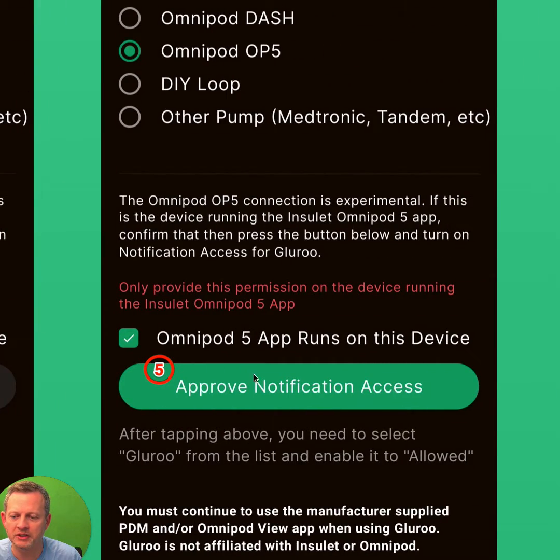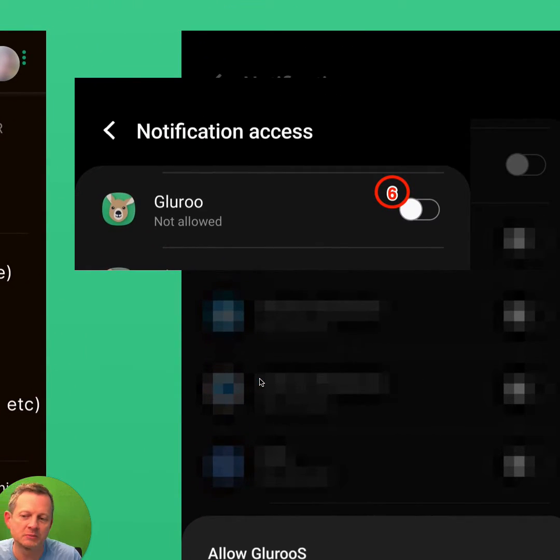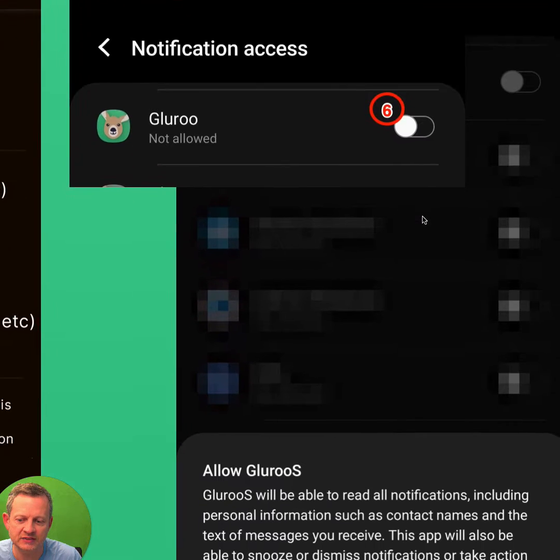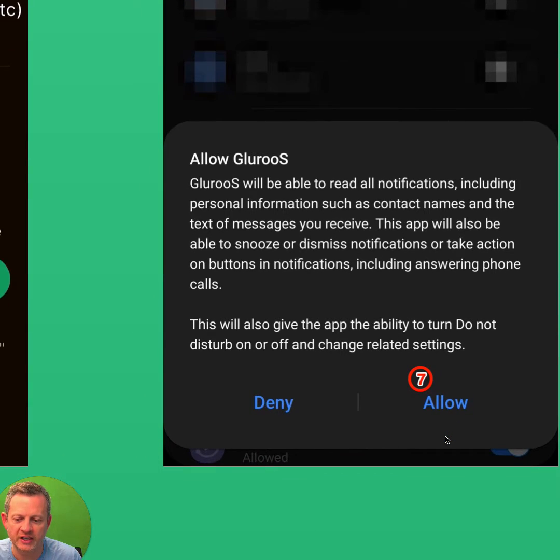That'll enable this button that you then tap to approve notification access. When you've done that, it'll open an operating system list of apps. You'll need to find GlueRoo in that list of apps and tap this slider to enable notification access for GlueRoo, and you'll subsequently click Allow to give that operating system level permission on your Android device.